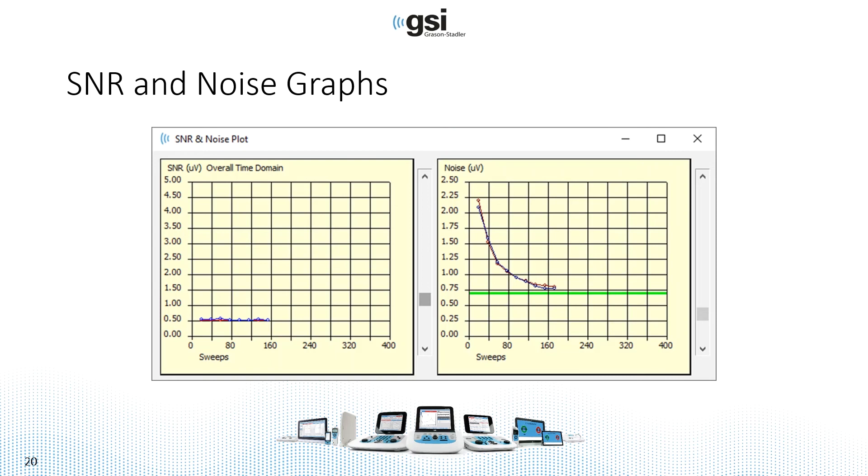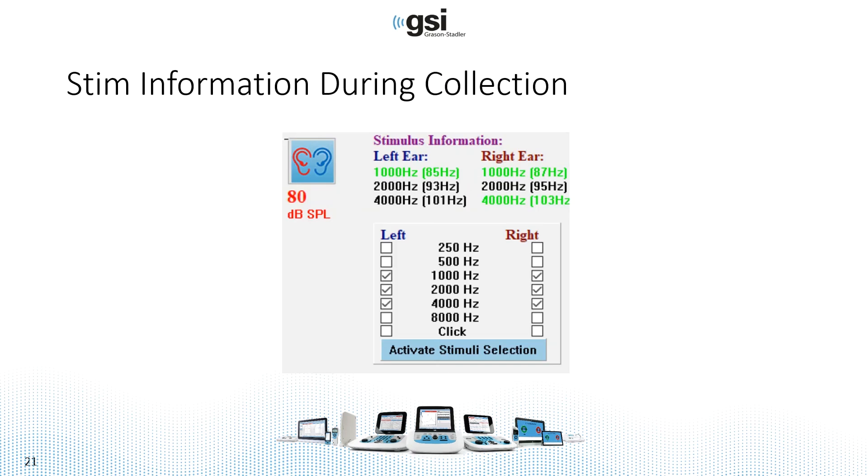The bright green line in the noise graph is the stopping criteria for noise. So if noise gets down to 0.7 microvolts, you should be able to see a response there. And if it's not there, then you should probably stop the recording. So it will automatically stop once the noise gets that low.